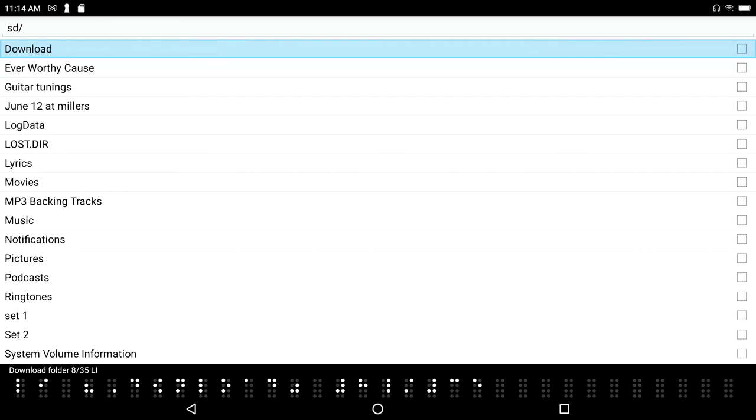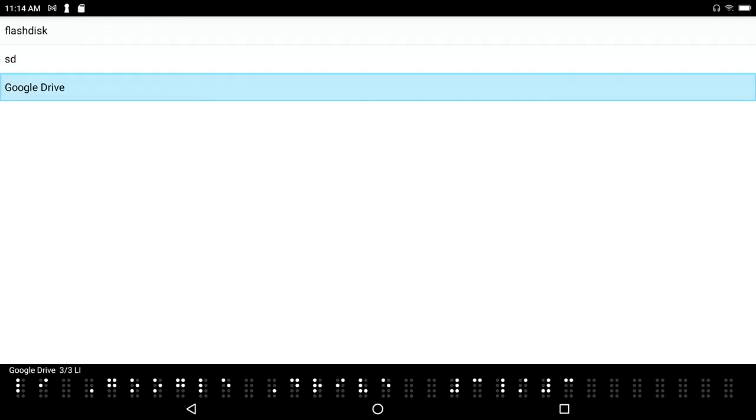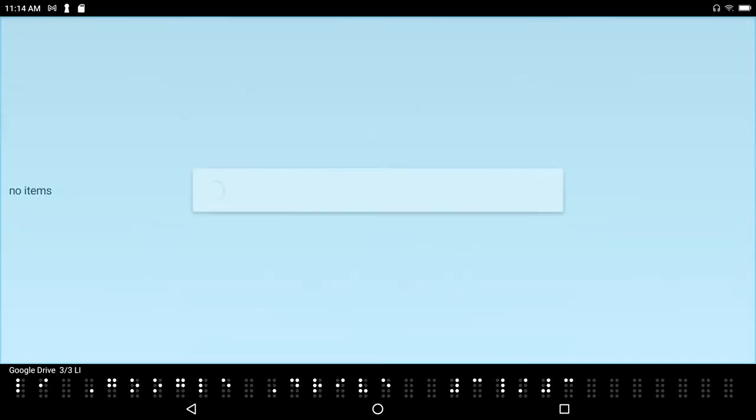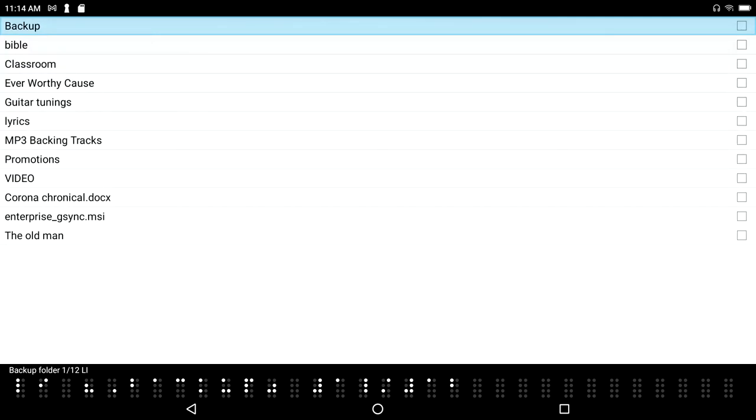So like I said, if you care about something you back it up. If you really care about something, you'll back it up twice. So I'm going to backspace to go back up to my list of drives, and this time I'm going to go down to Google Drive. Backup folder - there's one folder called backup. And let's just say that I'm going to just put it all here at the root level of my Google Drive.